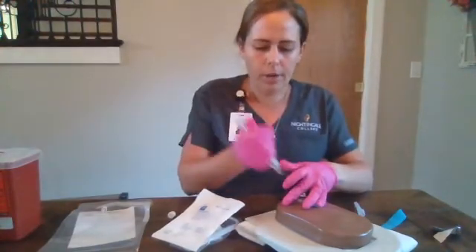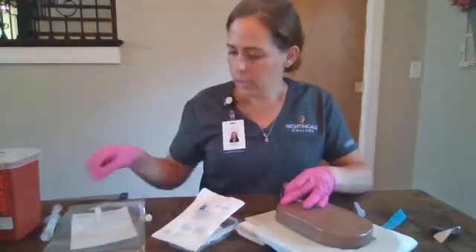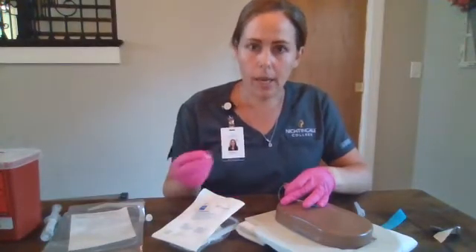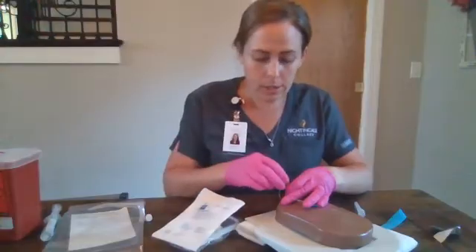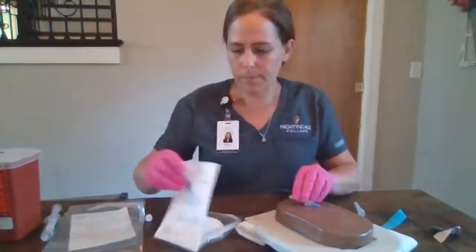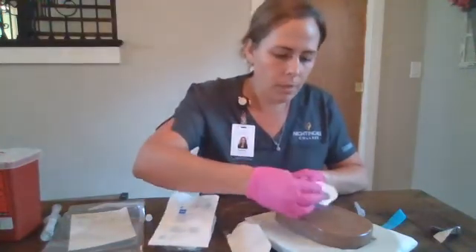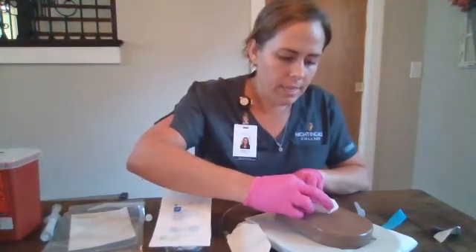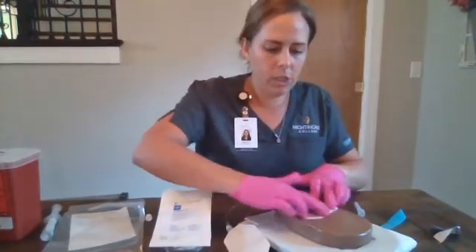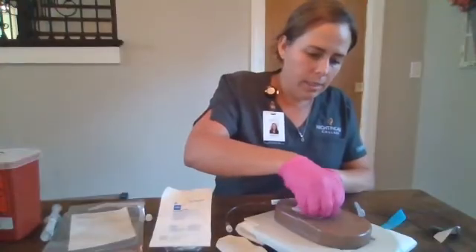We'll clamp off our tubing and we will discard our saline. Ideally we have a luer lock cap for this extension tubing; if not, then we will get a sterile cap to ensure that that end remains sterile. We are going to place our tegaderm so that our IV site is visible as well as the connection points between the catheter and the extension tubing.